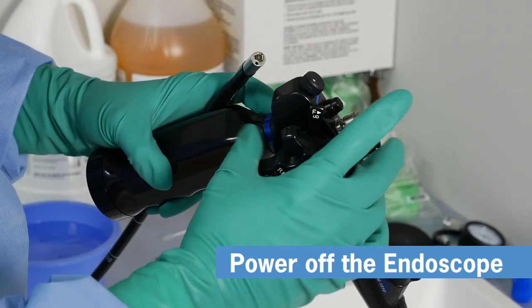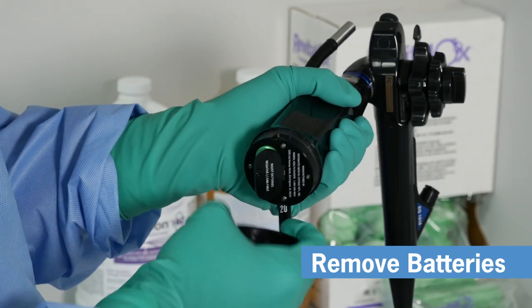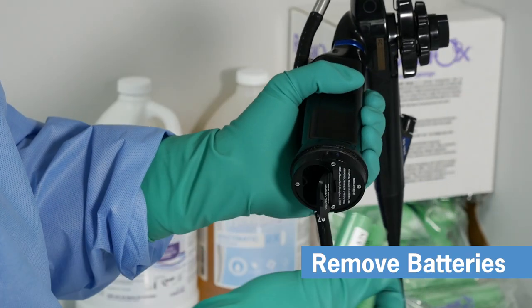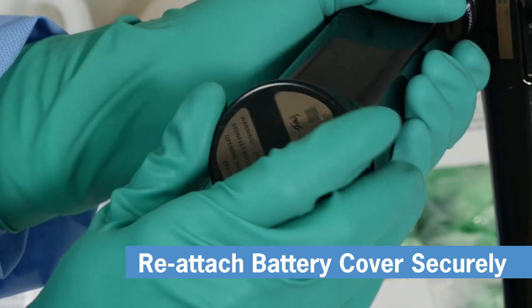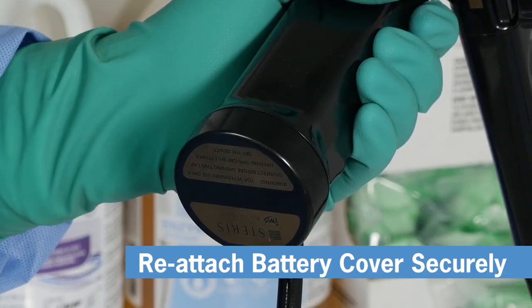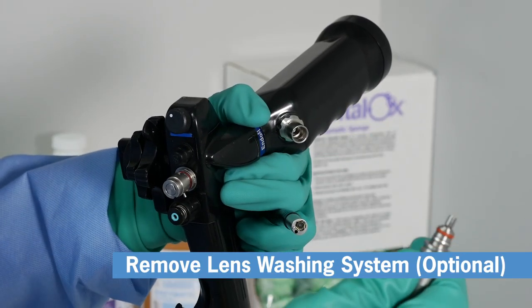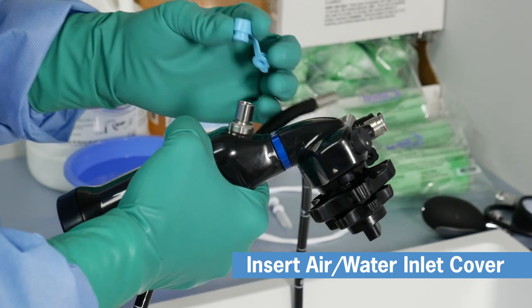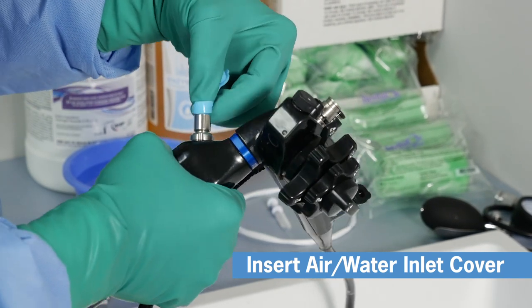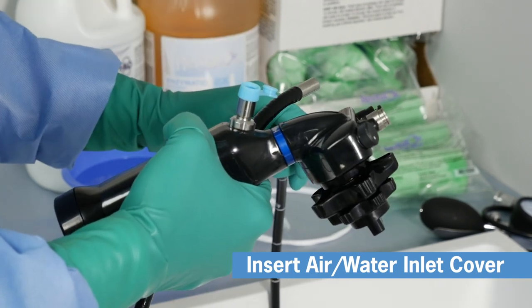Immediately after the procedure, power off the endoscope and remove the batteries. If using the optional lens washing system, remove it now. Next, take one of the included blue air water inlet covers and insert it into the air water inlet port. We'll flush this port later in the process.